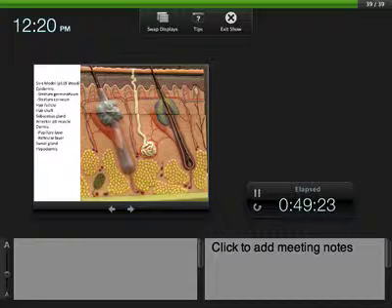This is then the dermis down here below the epidermis, and then where the fat starts, from about right here down, this would be hypodermis. So the papillary layer of the dermis is this thin layer right up here, followed by this reticular layer just below it.